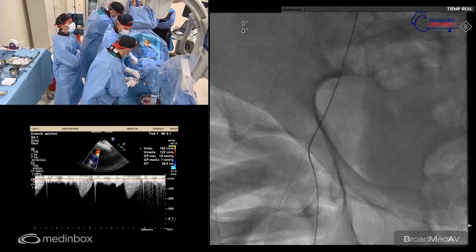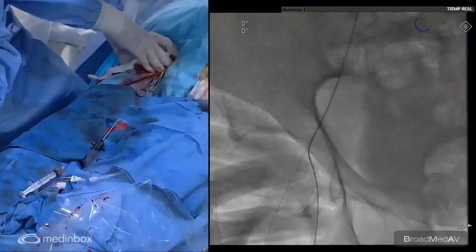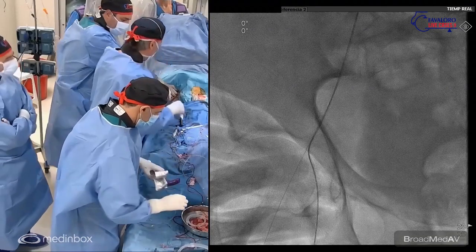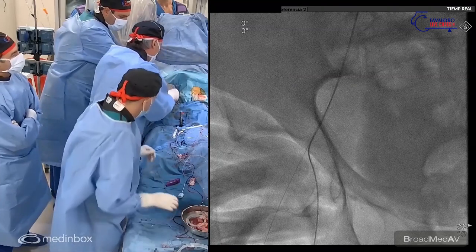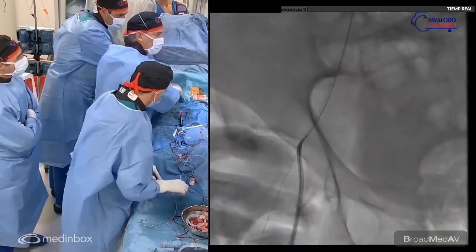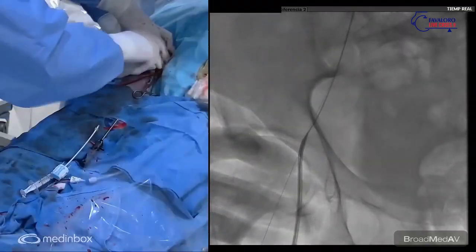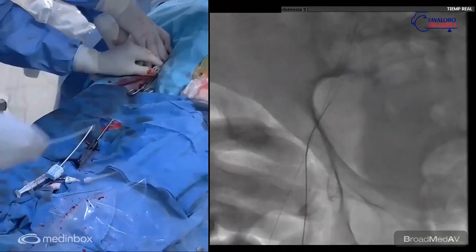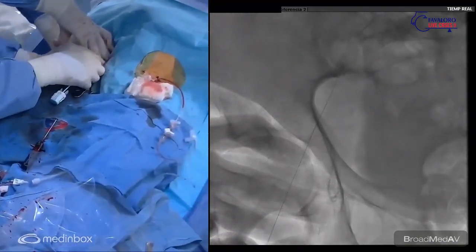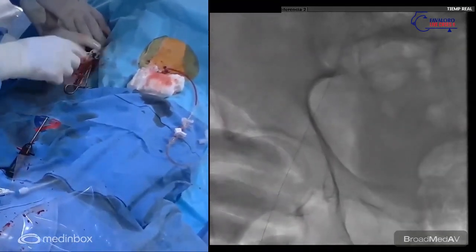Thank you. So we have almost 100 valves. I think it was 85, 86. The rate of pacemaker is less than 10%. We haven't seen any very important complication. We have a couple of ARs that were not due to the valve, but more to the positioning. So we have to make sure that the positioning of the valve is correct.